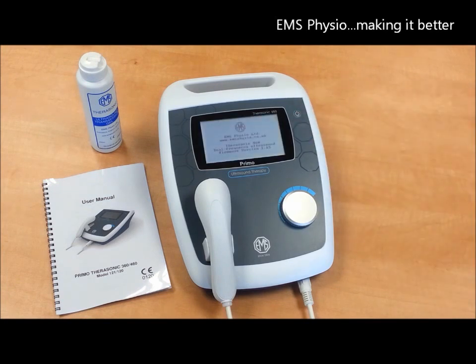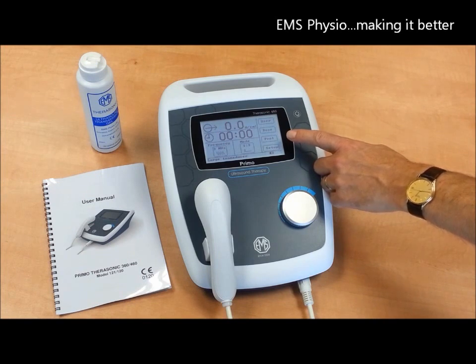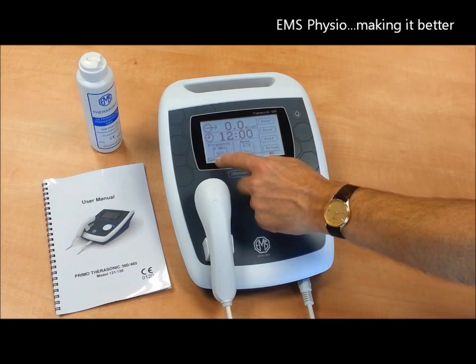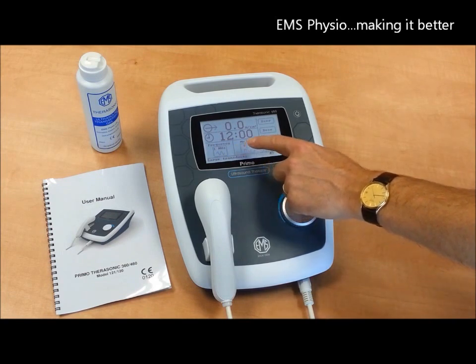One of the benefits of the Therasonic 460 and indeed any product from EMS Visio is that it is so simple to use. All the settings are controlled via this touch screen and allow you to set up the machine to your desired requirements. You can quickly and easily set the time, the frequency, and the pulse duration or the continuous mode.